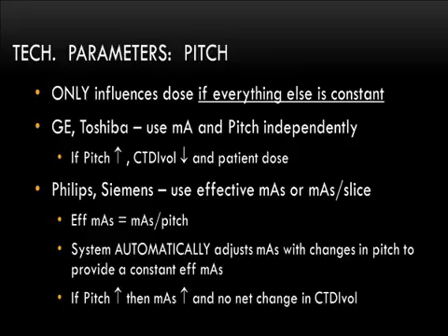I'm sorry, that's the state of our industry and our practice right now, so that pitch is inconsistent. In some situations, it does change the dose. In other systems, it does not. But that will be reflected in the CTDI vol, either pre-scan or post-scan. So you can see that.